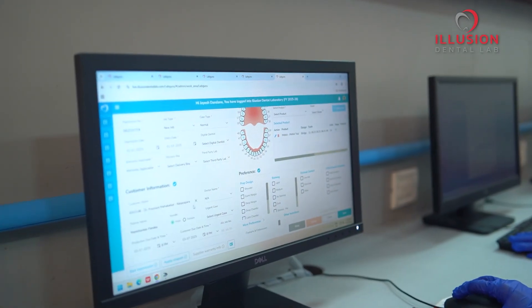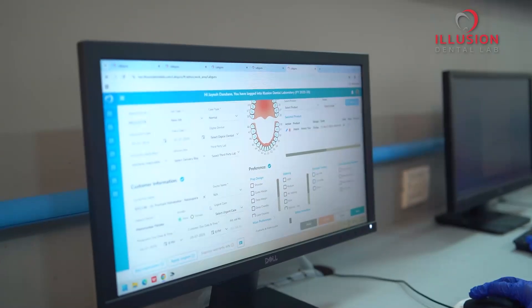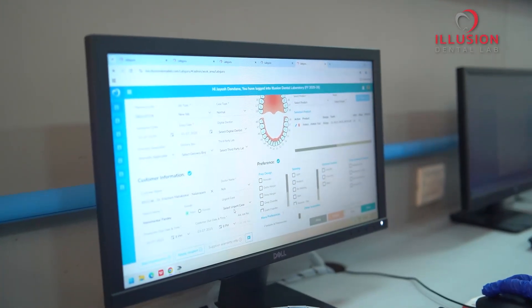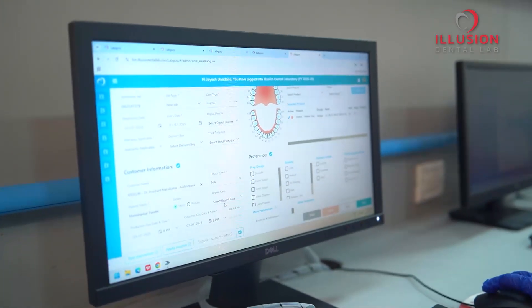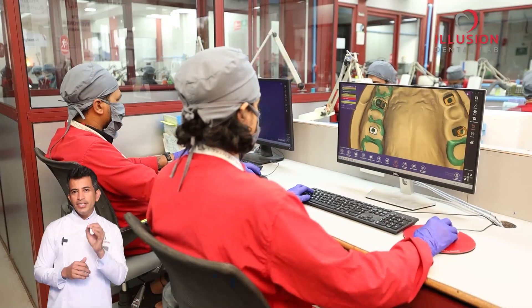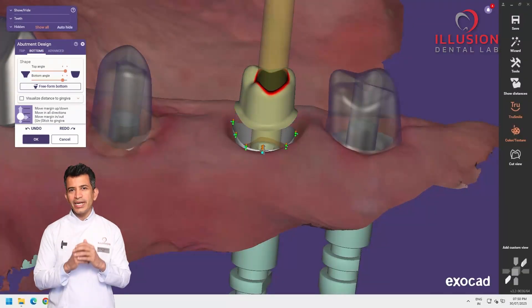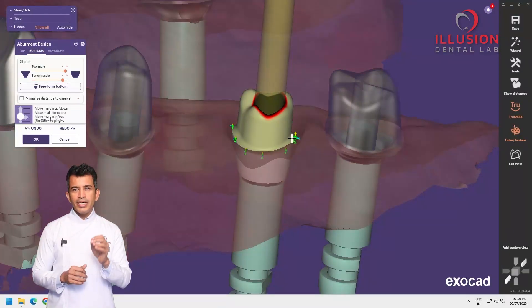Let's learn about Illusion's smart abutment workflow. Once we receive the scans, we register the case, verify implant details and move straight to the smart abutment design stage.